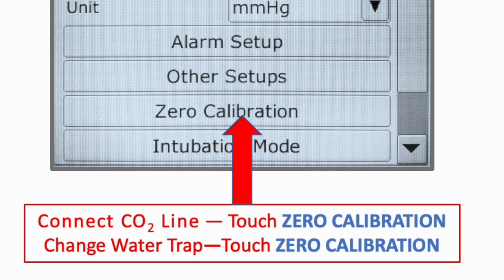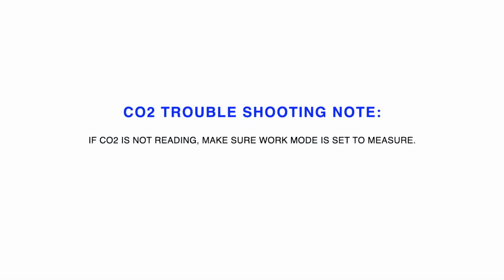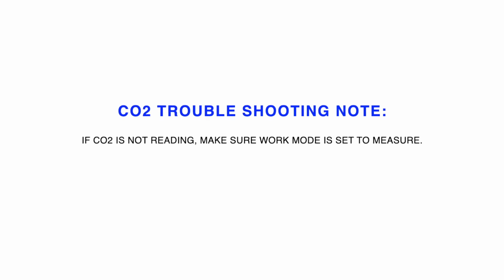If the system displays breath detected or zero required, zeroing has failed. Zero calibration should be performed again. Remember, if CO2 is not reading, check the work mode to make sure it is set to measure.